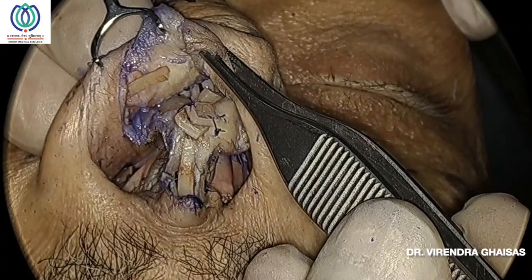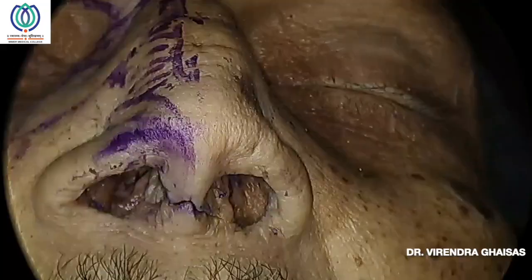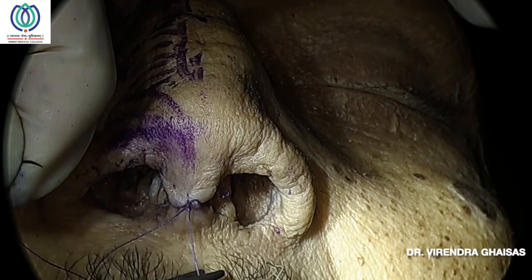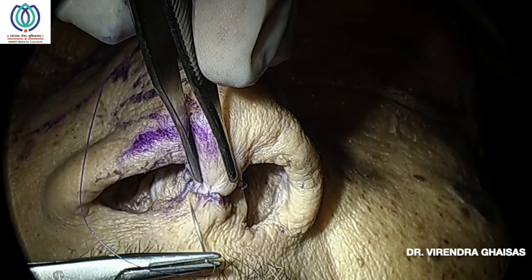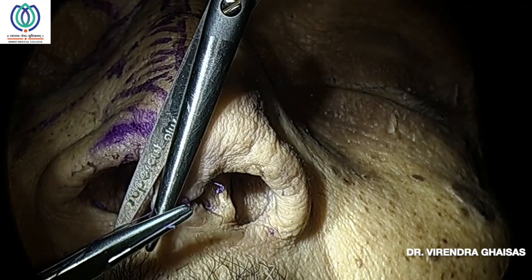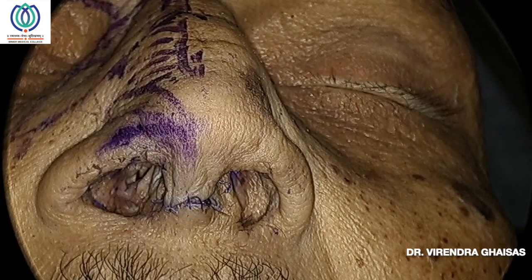Suturing is really important to avoid scarring. A scarred columella or post-op scarring and a bad scar is not a problem of the technique, but a problem of the surgeon. If the surgeon has not carefully sutured with 5-0 or 6-0 sutures, then definitely the patient in the post-op will have scar formation. So it's really important to suture gently to avoid notching and to avoid scar tissue in the post-operative phase.